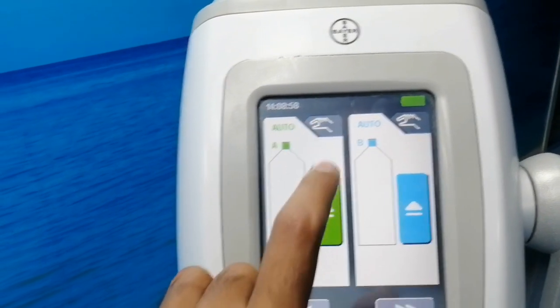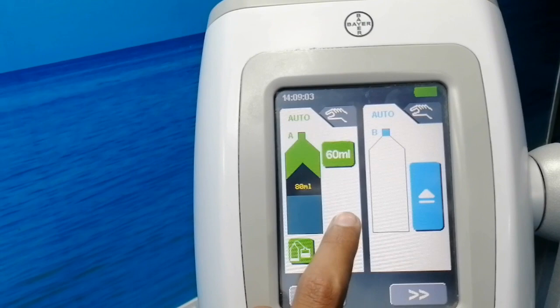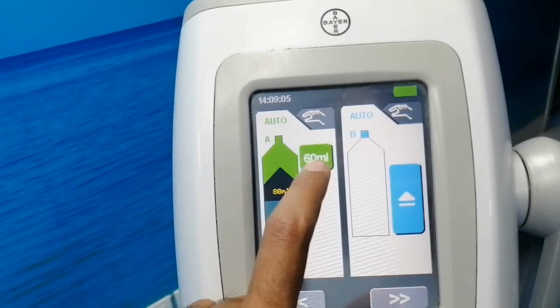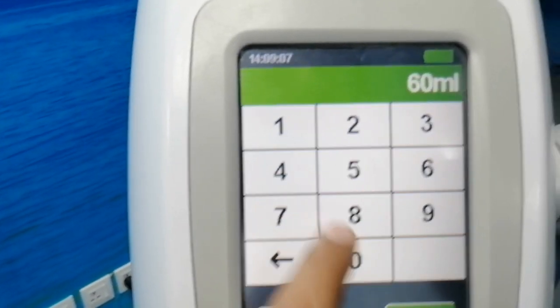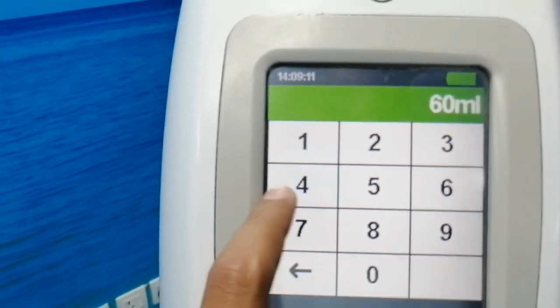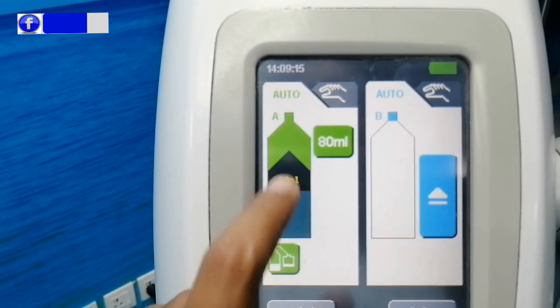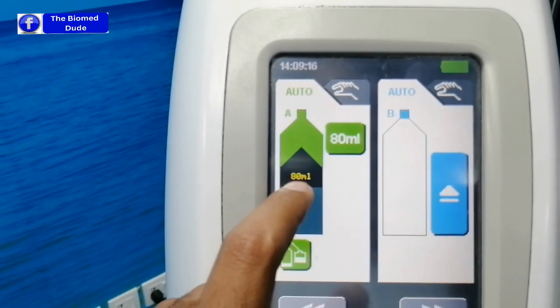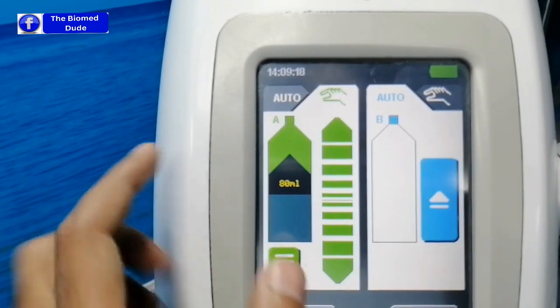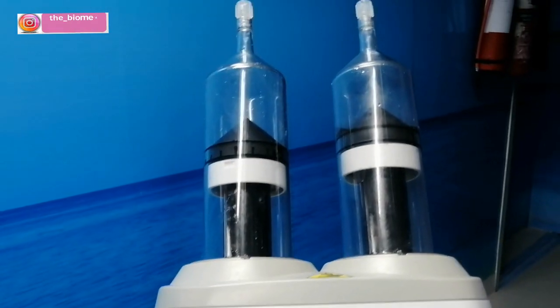I just press the auto filler and here are the settings — currently at 60 ml, the total value of the syringe. I can press a different value like 80 ml. Here is the auto filler and now the setting is 80 ml. There is also a manual mode where you can increase or decrease the volume of the syringe.